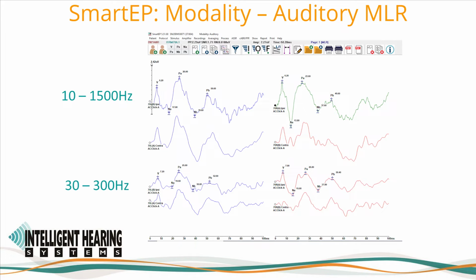Monitoring of the PB, or the P50 response, provides evidence of maturation and has been shown as delayed in hearing loss individuals. It can also be used in discrimination gap detection assessments. Research has shown a significant difference in MLRs between learning disabled children and normal hearing controls. Case studies have also been presented in the literature of children with normal ABRs but absent MLRs.